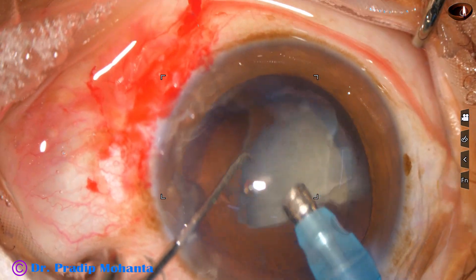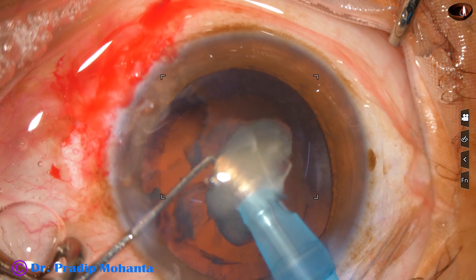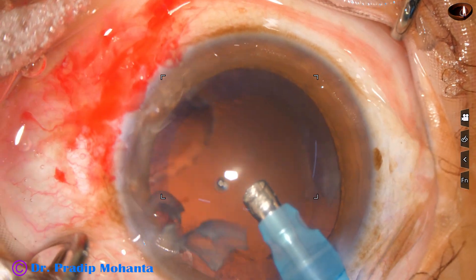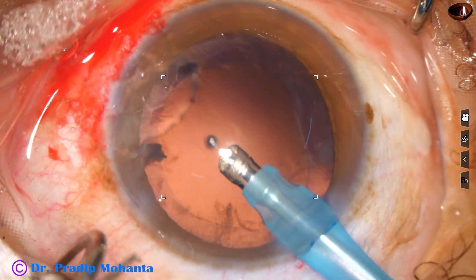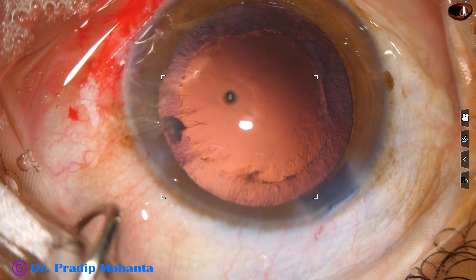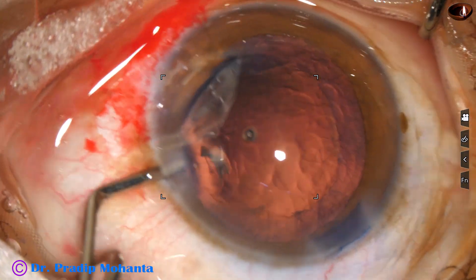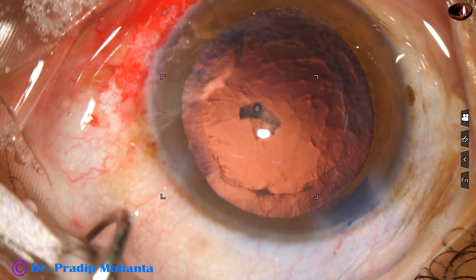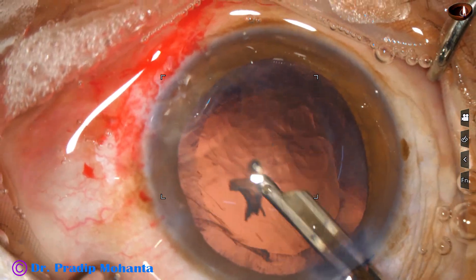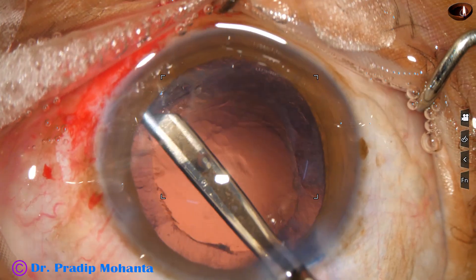This is the last piece. At this time the parameters are reduced — vacuum and power are reduced for emulsification of the last piece. These are the last few bits of nucleus. One nuclear piece is at the left side; we have to remove that first — it should not get lost under the iris. With the help of the Simcoe, bring it near the main wound, depress the posterior lip of the main wound, and it comes out.